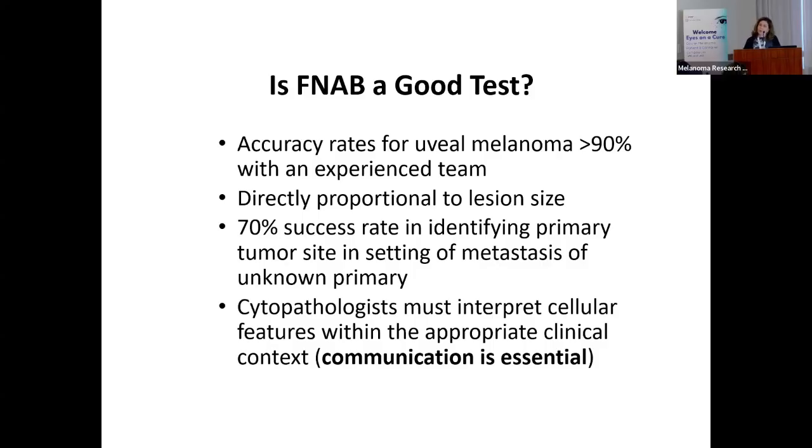We're also able, in those cases where a patient might unexpectedly have a metastatic tumor to the eye, to have a 70% success rate in identifying the primary tumor, saying, hey, this is not a melanoma, this is a metastatic lung carcinoma. And so it is a pretty good test.